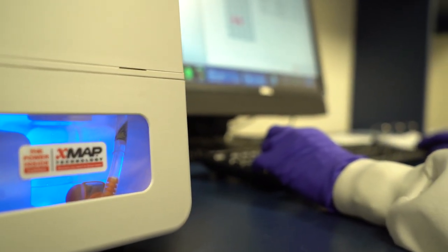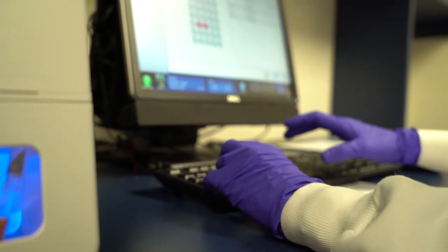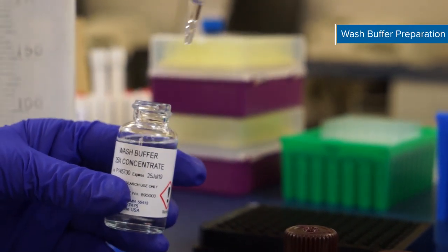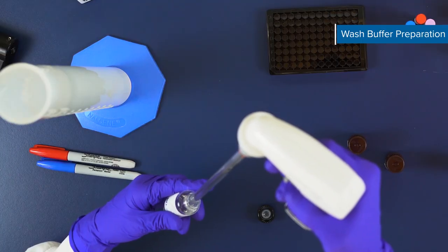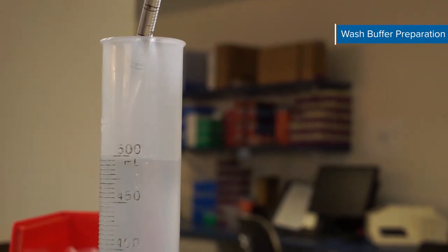Once your instrument is ready and your reagents have warmed to room temperature, prepare your wash buffer by adding 20 milliliters of wash buffer concentrate to 480 milliliters of deionized or distilled water in a graduated cylinder to yield 500 milliliters of wash buffer.